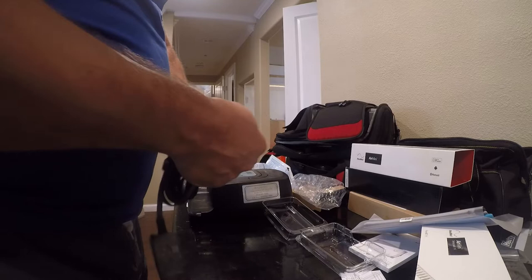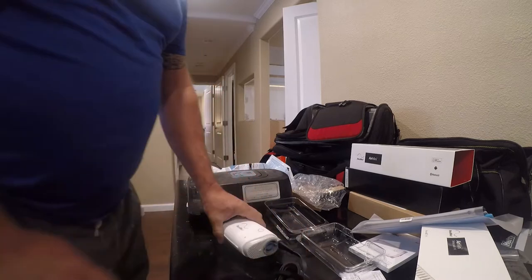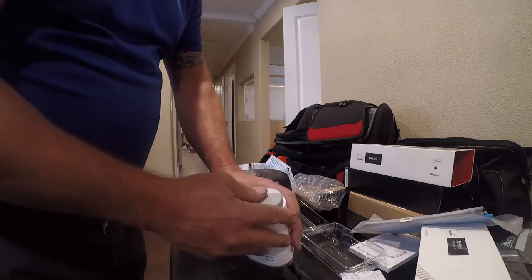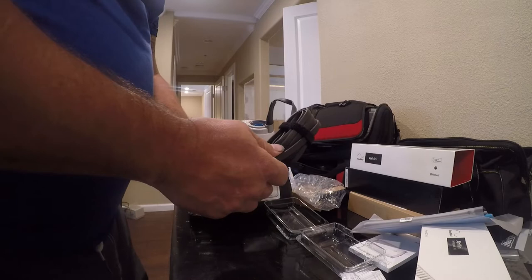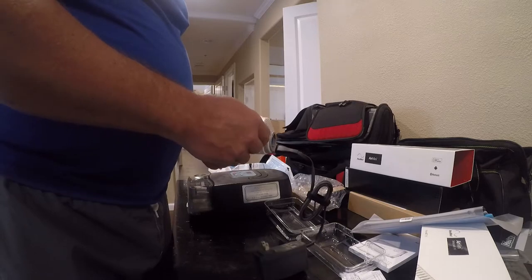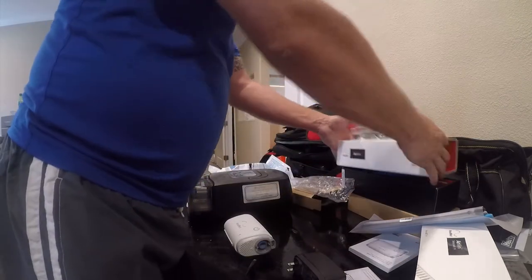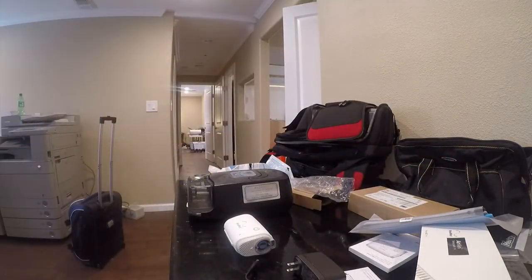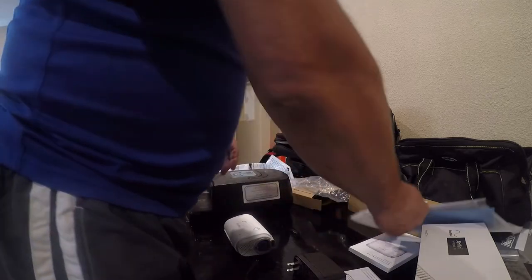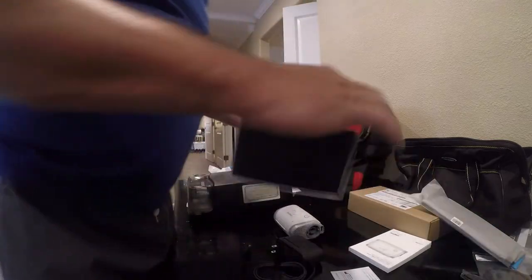That's the cord — it'll plug in here. It does lock. This is really tiny; I could use this in any number of places. There's a little filter here. It was kind of expensive — like $1,300 properly set up. I feel bad about that, but I can't sleep without this. So I went ahead and bought their setup pack.